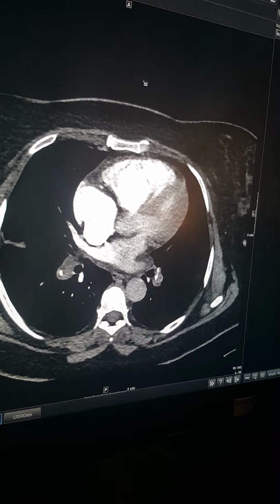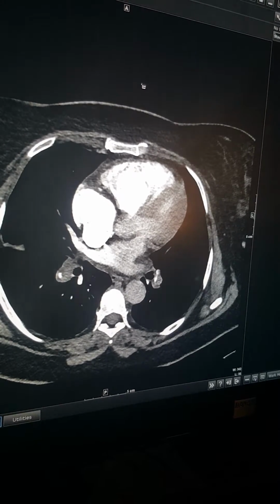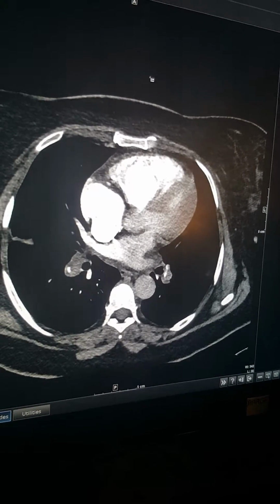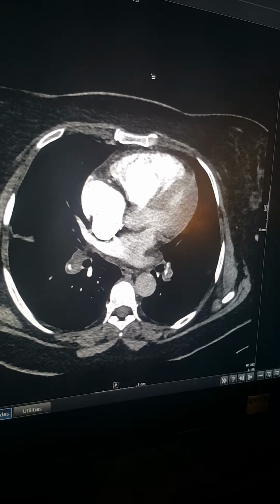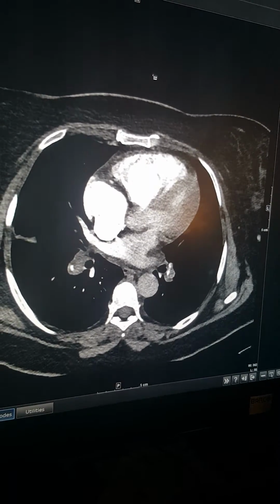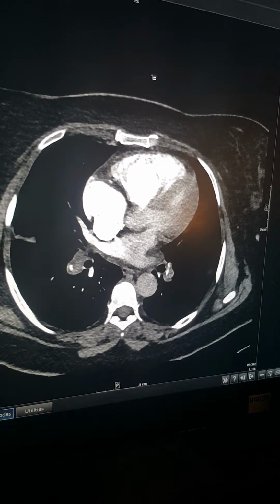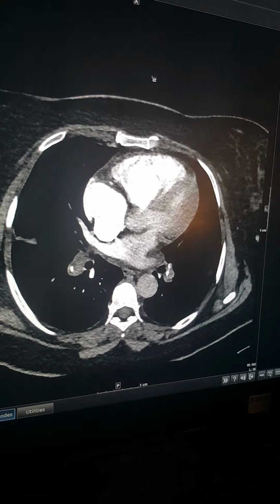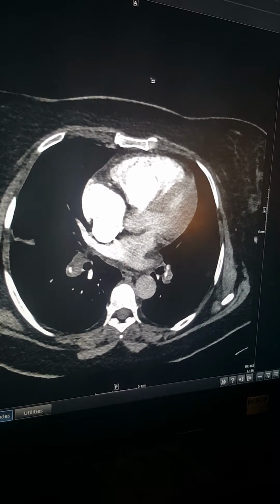There is a controversy. Is it a CT angiogram or a VQ scan? So would you like to enlighten us about this? Absolutely, yeah. So in pregnancy, you would likely start with the lower limb Doppler, and if it's positive, that will give you a hint and there's no need for CTPE or VQ. If it's negative, then there is a question about using CTPE or a VQ scan.